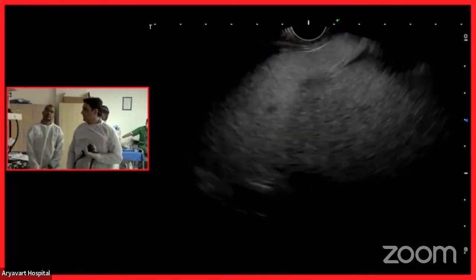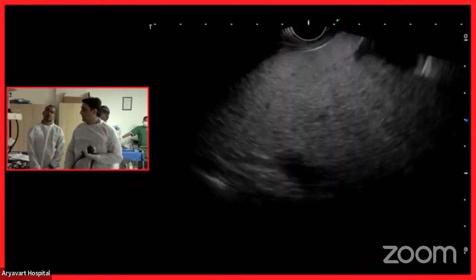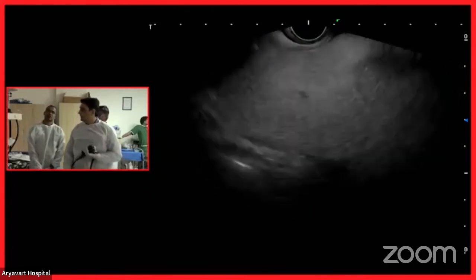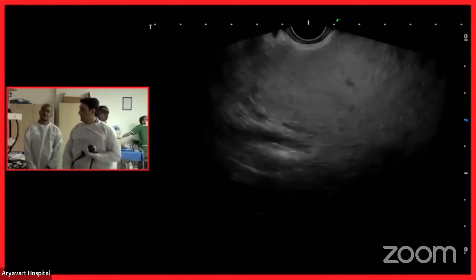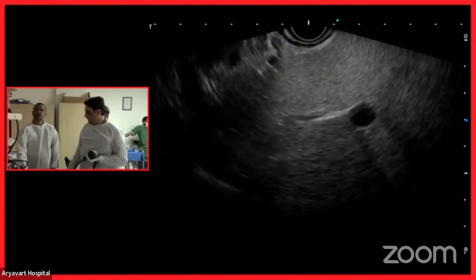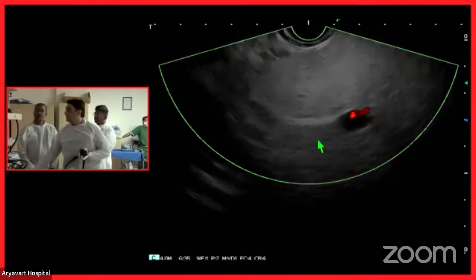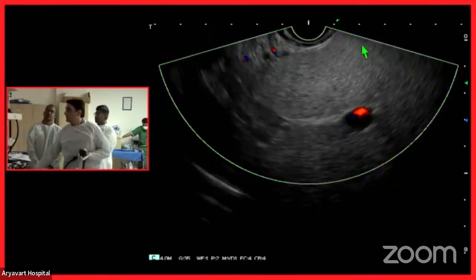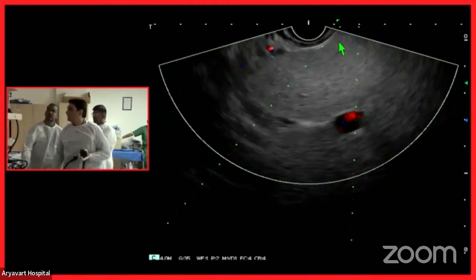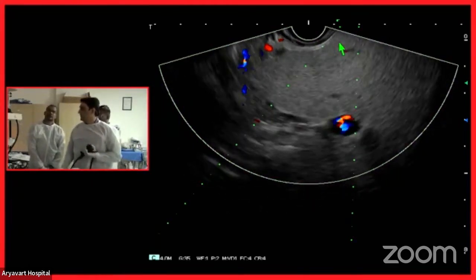Now I have to find, because I'm a little up, we can see a part of a branch of hepatic vein here and a part of IVC. So I'll just push it in between and go toward the deeper segment of liver. So here we see an avascular area. And when I see my arrow, my needle will be coming somewhere like this. We have needle data. Okay. So from which segment are you planning to take the biopsy? Most likely this is segment 2.